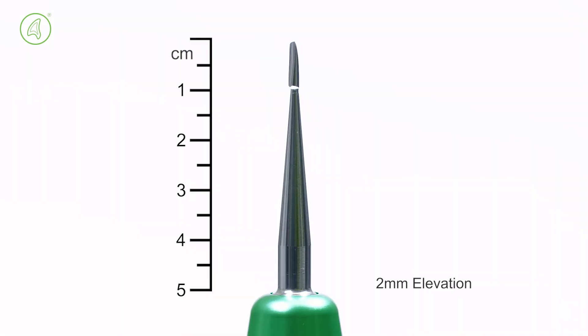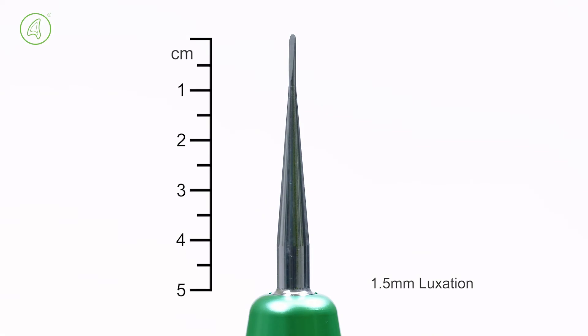Elevation blades from 2 to 5 mm to twist and stretch the periodontal ligament. Luxation blades from 1.5 to 5 mm to gently sever the periodontal ligament.